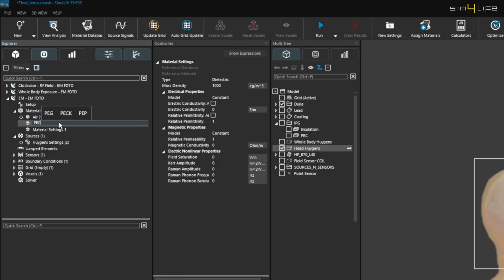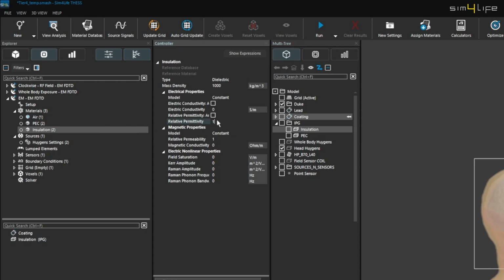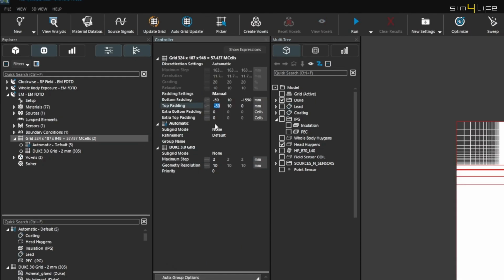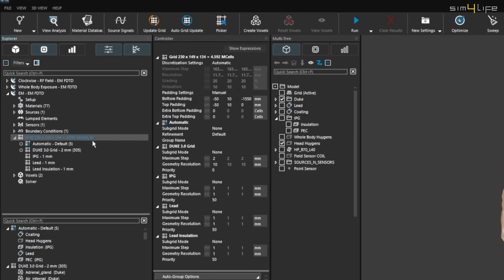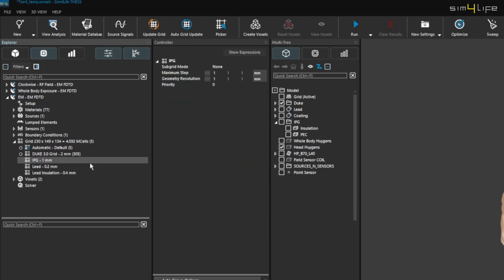The implant's lead and the IPG components are designated as perfect electric conductors. For the insulative parts, dielectric properties with a relative permittivity of 3 and 0 conductivity are applied. We adjust the grid padding settings from automatic to manual to limit the computational space around the implant. We define specific grid settings for different parts of the implants, with a finer grid in the region of the lead.